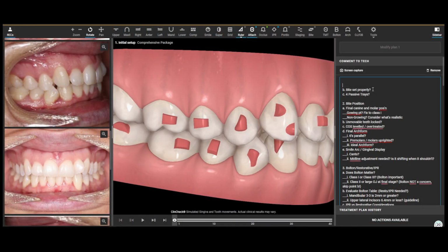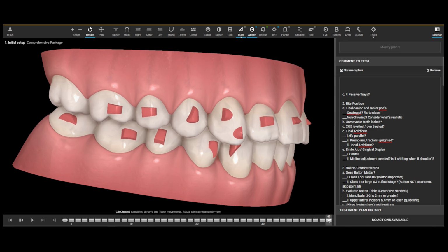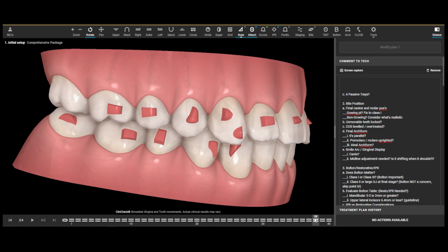And if you're in treatment with a patient, you can jump out, do the root canal, and when you come back, you know you start at the exact same position here of, yes, the bite was set properly. Now what we're looking at is, did they give us 4 passive aligners at the end of this batch of trays? So what does that mean? 4 passive aligners. Well, the last 4 trays, ideally, in all of our ClinChecks, we want them to set the plan up so that the last 4 trays are identical. They don't move the teeth at all. Well, that's not happening here, right?